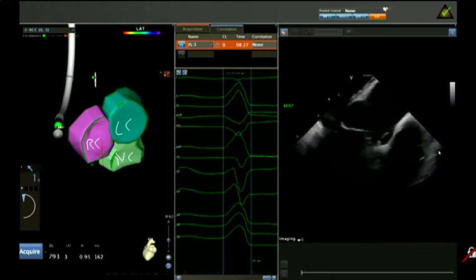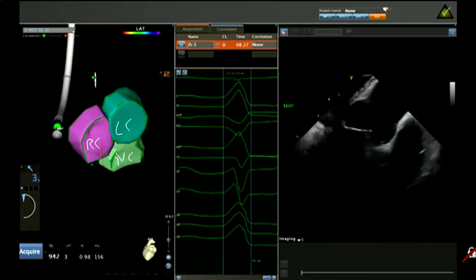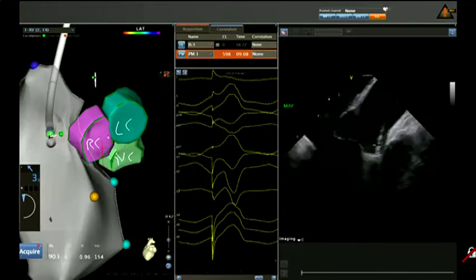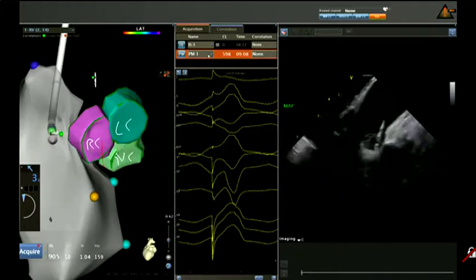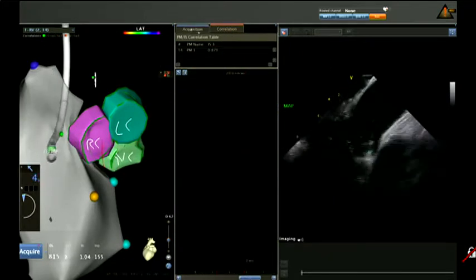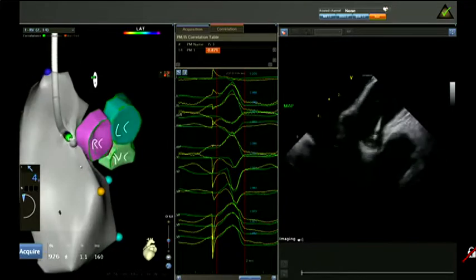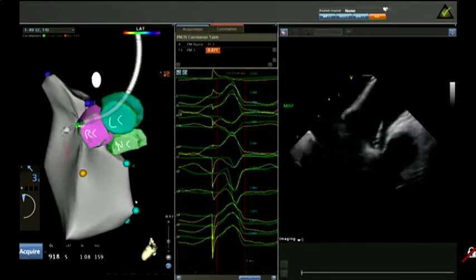So this changes the situation, because if we have a lower axis, but it moves to the left because D1 is positive, the only way to explain D1 positive is that it goes from right to left, but D2 more positive than D3. So it has to be either in a septal structure, the outflow tract of the right ventricle septally, because it's an early transition and from right to left. So it should be more septal posterior, or on the opposite side.